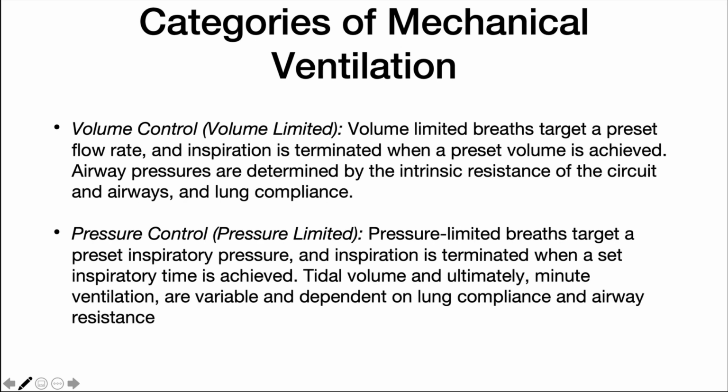Pressure control is another mode of operation as well, and here we're targeting pressure limited breaths to a preset inspiratory pressure. And so inspiration is terminated when a set inspiratory time is achieved. Tidal volume and ultimately minute ventilation are variable and depend on lung compliance and airway resistance.